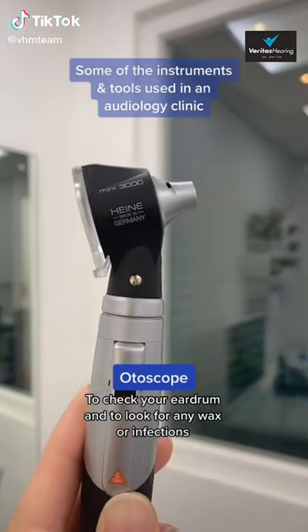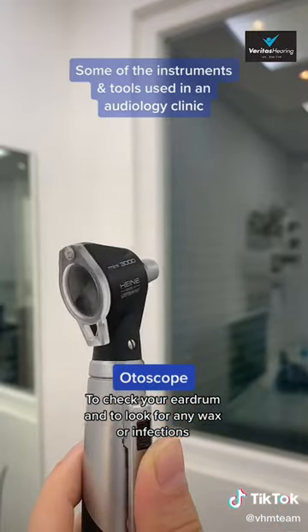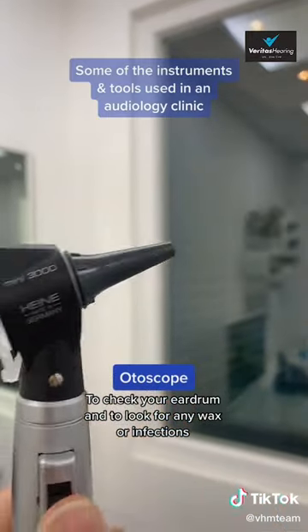This is an otoscope. This is what audiologists use to look into a patient's ears to see if there's any wax or infections, and to make sure the eardrum looks nice and healthy.